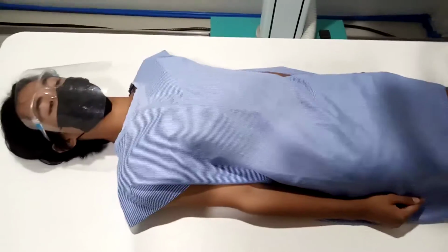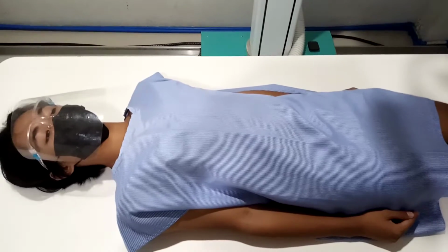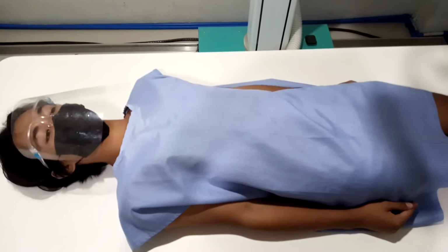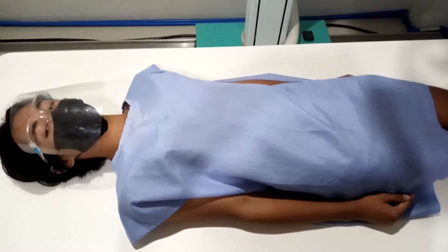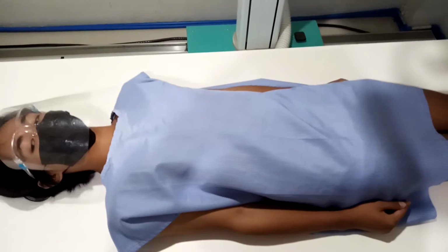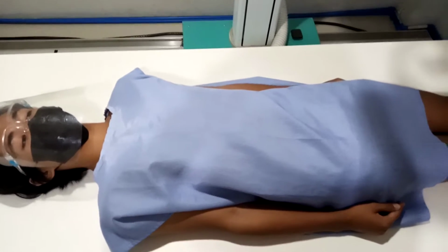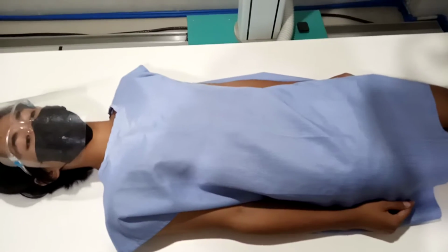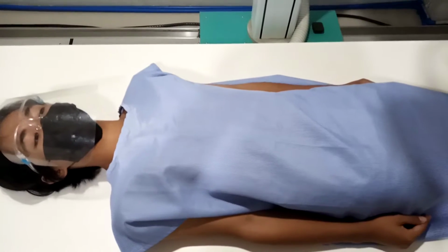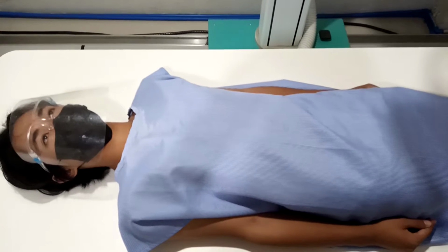Then center the IR at the level of the cervical spine and adjust a line between the upper occlusal plane and mastoid tip perpendicular to the IR. Always remember that you need to shield the gonads of the patient because gonads are sensitive to radiation. So, instruct the patient to suspend his breathing before exposing the patient.